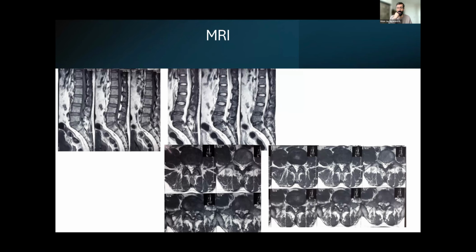Yeah, sorry, Dr. Bishnu. Go ahead, finish your thought. Yeah. So once we remove the large fragment, as I mentioned in my presentation, there will be some amount of bleeding. When we decompress adequately, there will be some bleeding. That is one of the signs of adequate decompression intraoperatively. Thank you. You made that point very well in the presentation. Sorry to speak as a non-spine surgeon here, I'm just curious, is there an advantage to doing this endoscopically versus doing it open?